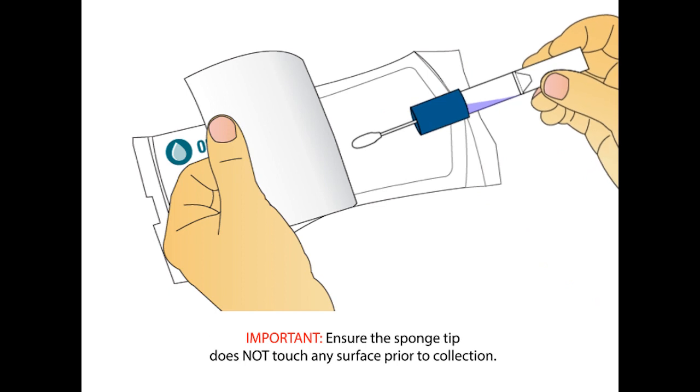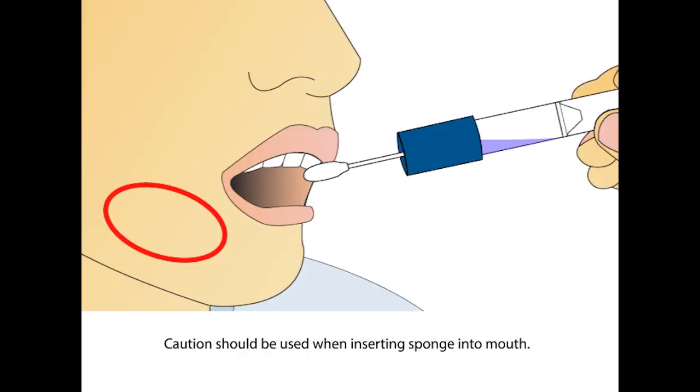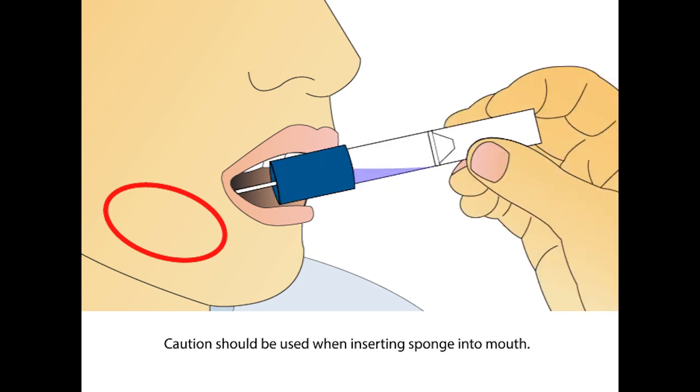Ensure the sponge tip does not come into contact with any surface prior to collection. Place the sponge as far back in the mouth as comfortable. Caution should be used when inserting the sponge into the mouth to avoid choking.